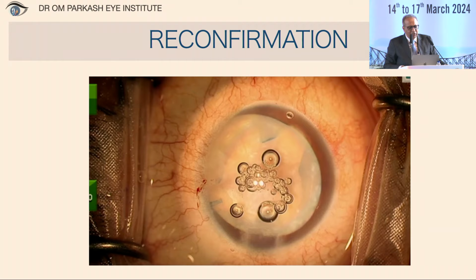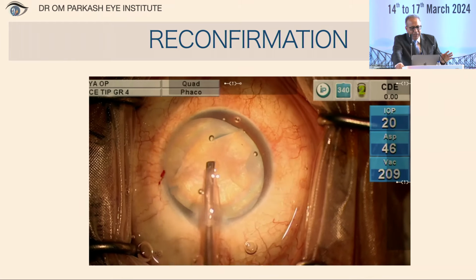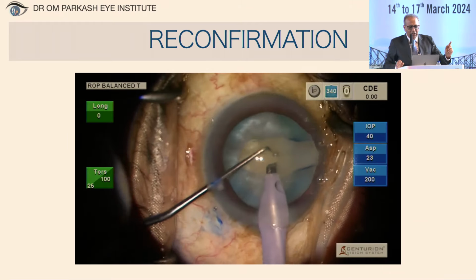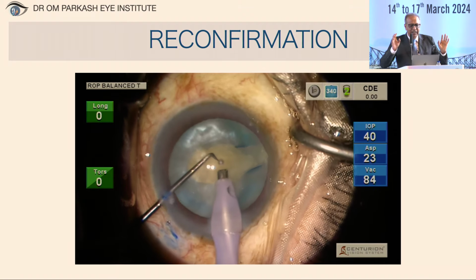Now let's reconfirm. How do we reconfirm? Put in your phaco handpiece, and before you really start, just irrigate. And if you find it is fluttering, this means it is pre-equatorial. Let's see another case scenario. Again, phaco handpiece, irrigating in, and it is fluttering.